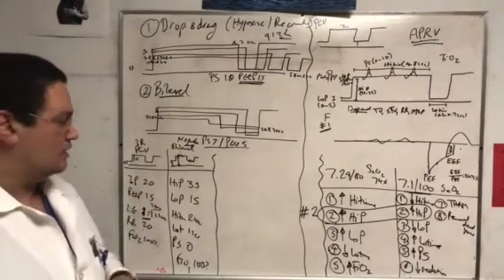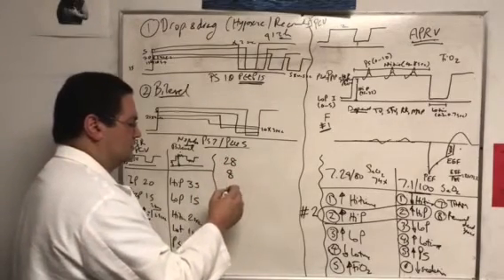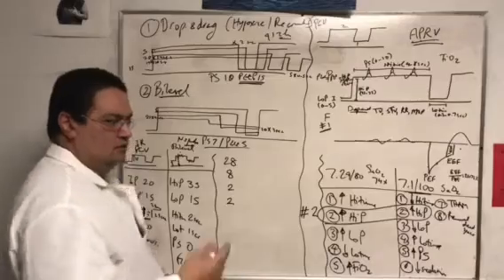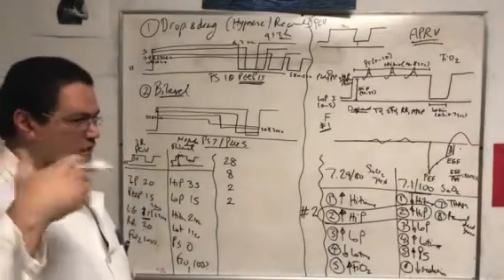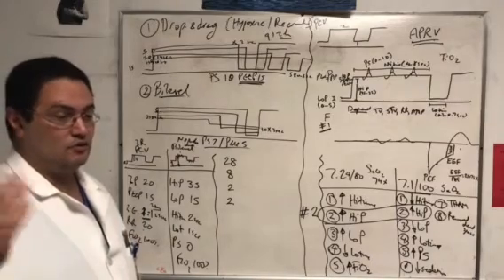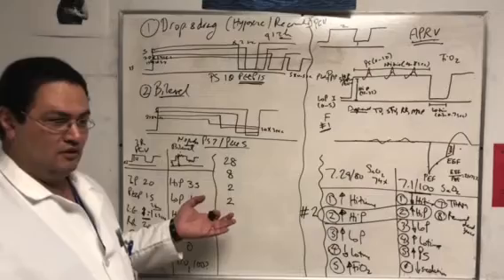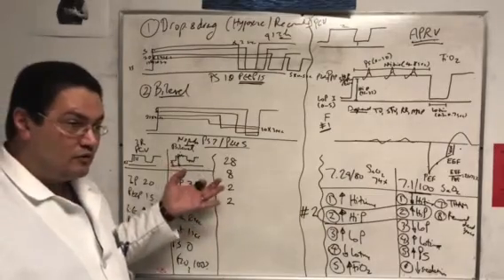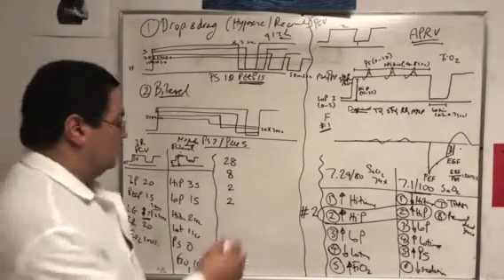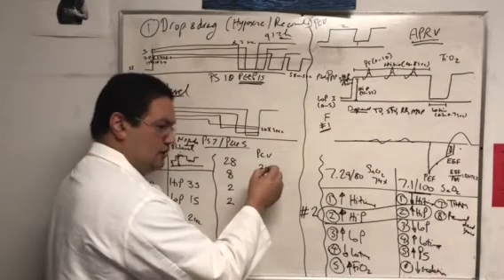So in order to encourage people to do it, we made a kind of a song or something, 28822. So it's always in your head, 28822, 28822, 28822. And if you forgot that, they know it so much, just say the usual. And they're gonna put it on 28822, right? Is that so far away from what we were using before? No. Actually, when we were using pressure control, typically we would use 20.